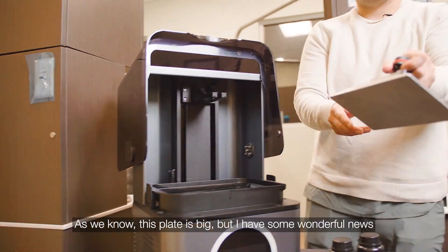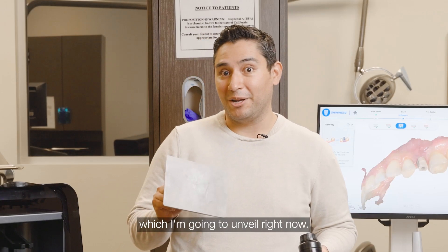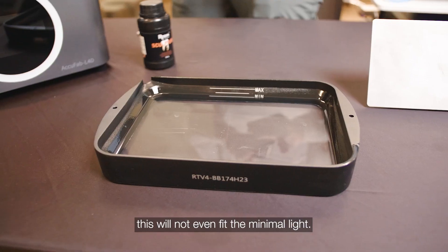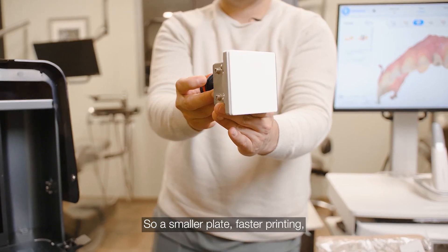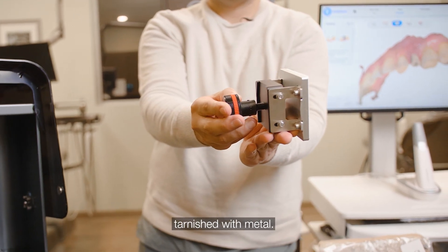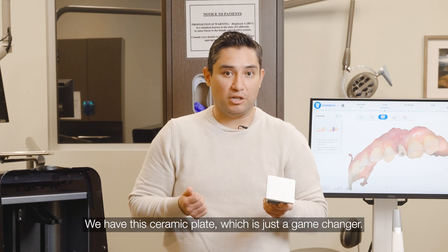As we know, this plate is big, but I have some wonderful news which I'm going to unveil right now. If we look at this humongous container, this will not even fit the minimal line. So we have a smaller plate, faster printing, and the one thing that makes a huge difference — our resin becomes tarnished with metal. We have this ceramic plate, which is just a game changer.